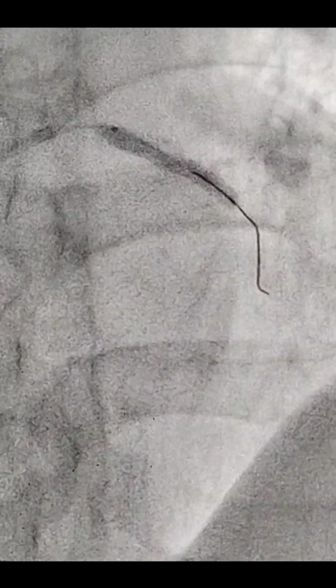We had that ramus also should not get compromised. So I put one end of the stent in the ostium LAD and then inflated at 14 atmospheric pressure. 16 was RBP and 8 was nominal. So this is at 14 atmospheric pressure. So in this view, you can see some sort of under expansion due to calcium, but not significant.